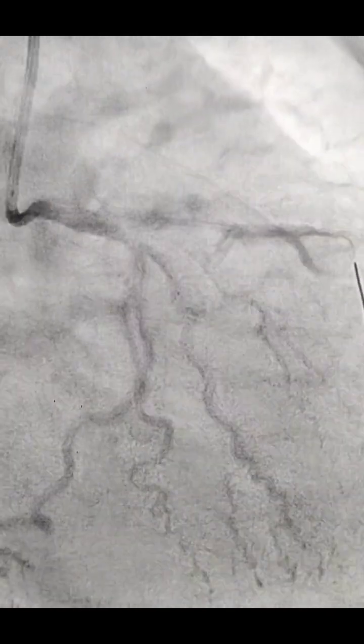So many times nothing will happen with some sort of organized thrombus. So this is the balloon daughtering. Balloon daughtering is a simple to and fro movement of the balloon so that the thrombus will get cleared and we will get flow. This was the balloon daughtering we have done in the hope of getting flow in the LAD. So as expected, flow has come, and you can see the probably plaque in the proximal LAD.